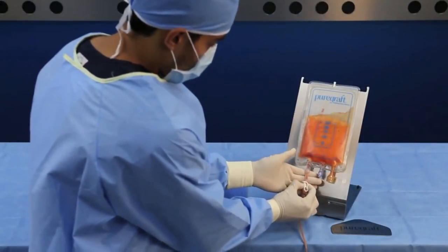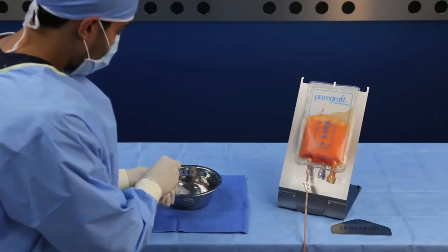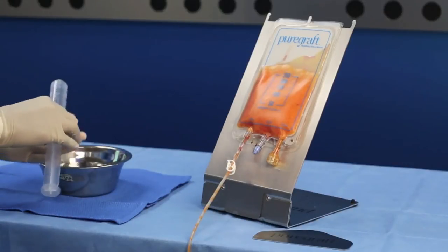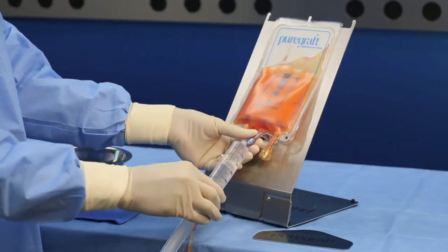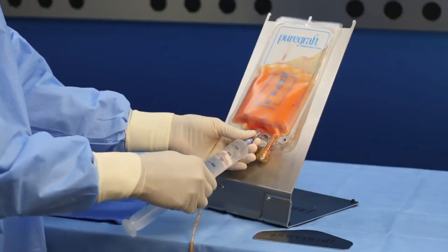The next step is to wash the tissue. There are two alternative methods for transferring the lactated Ringer's into the PureGraft. Both methods will be demonstrated in this video. The first method uses a syringe, the second method uses the inlet tubing set. You may use whichever method you prefer.